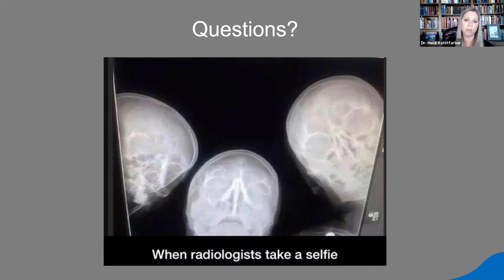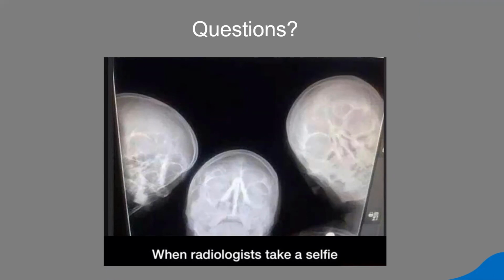We do need to document that we looked through them. And if you see something that you don't know what it is, then your ethical and legal requirement would just be to send that on for additional evaluation and use your radiologist just like you would for any of your other specialties. So, all right, last question.